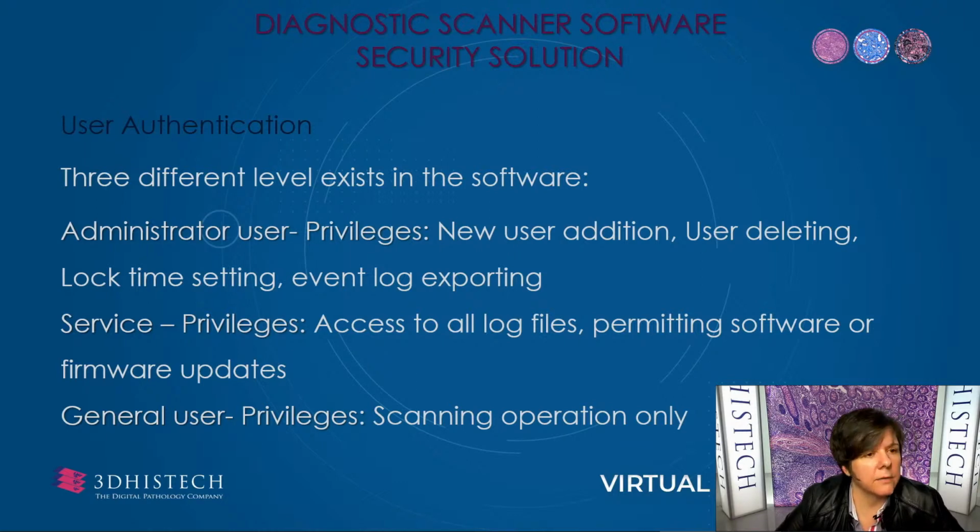The administrator user can add a new user and can delete existing ones, and can also export the event log files. Service privilege means the support or technician can access the log files and perform software or firmware updates. The general user can use the scanner software for scanning purposes.